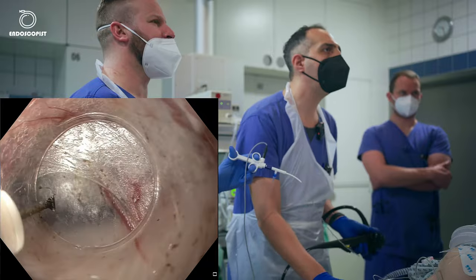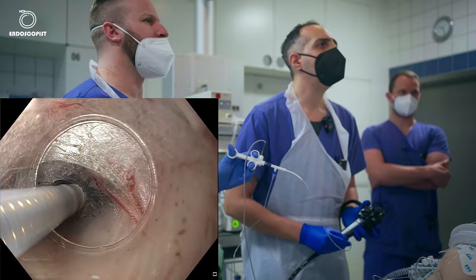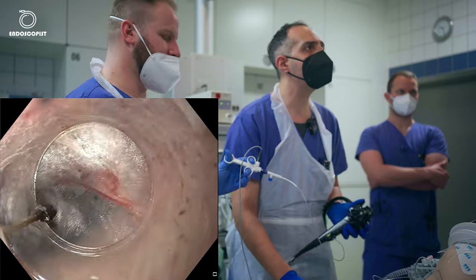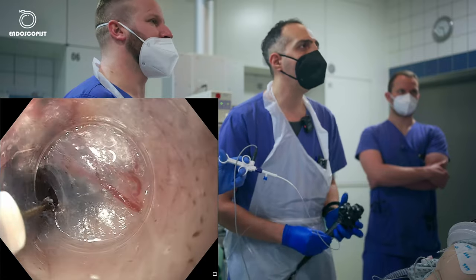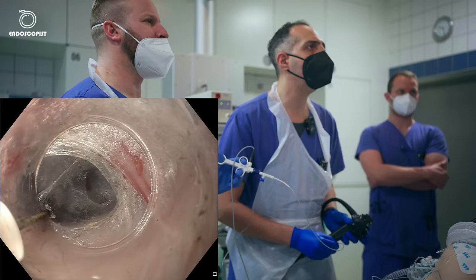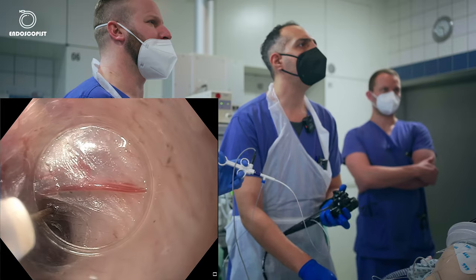Again, using the cap. Very nice. We are now at 40 centimeters, which means I believe we already finished the cardia, so I will go like 2 centimeters below it. We will have enough myotomy.